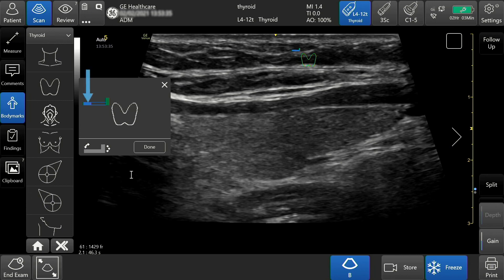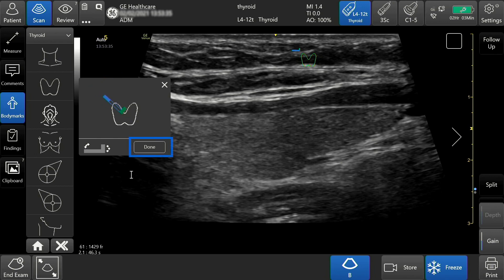Tap the solid blue part of the handle to rotate the probe. Tap the remaining portion of the probe icon to move it. Press done to close the large body mark.